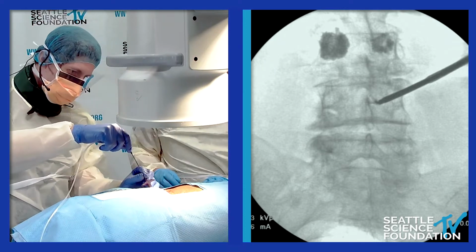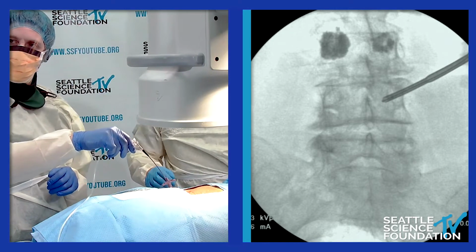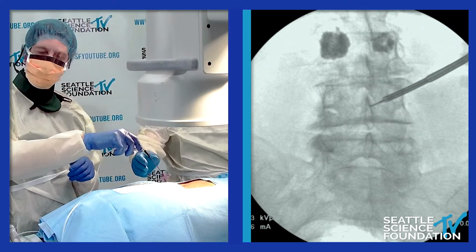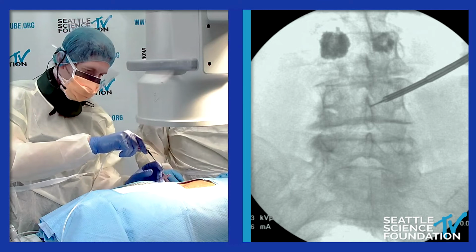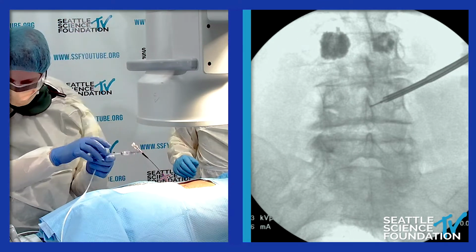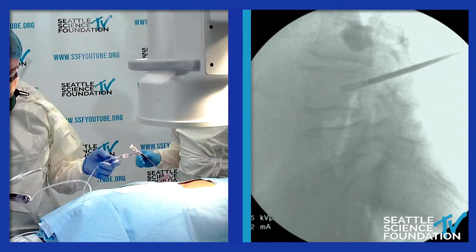within the balloon. Let's take a picture first. Enter further. And you want it outside the trocar. Take a shot. Let's go maybe lateral now. That's straight.